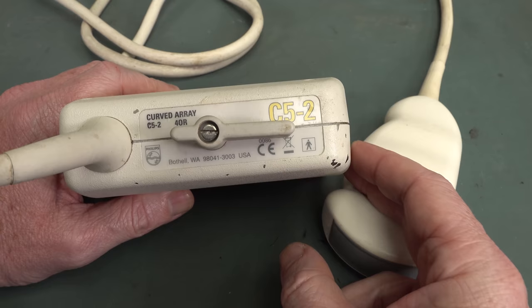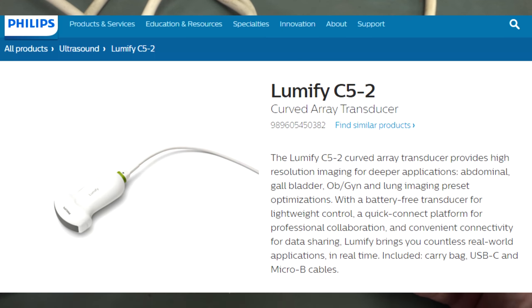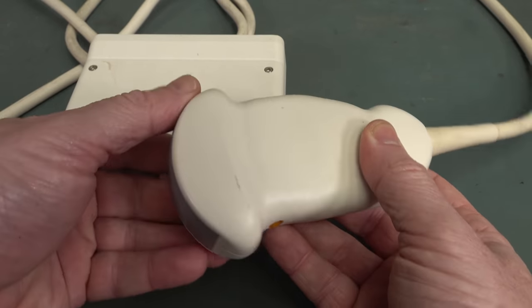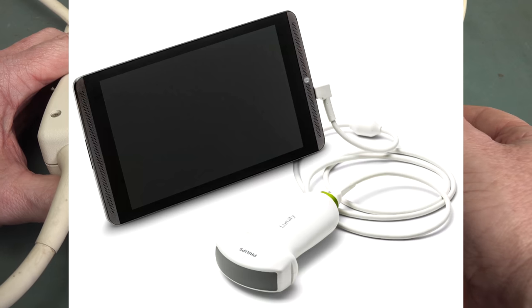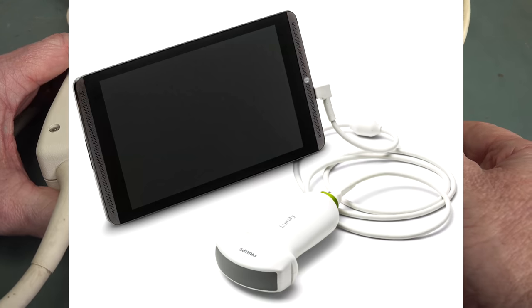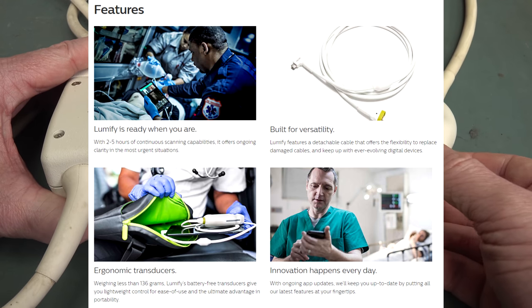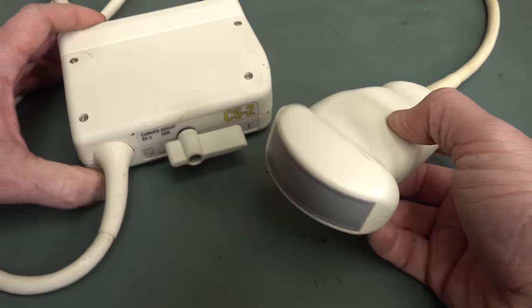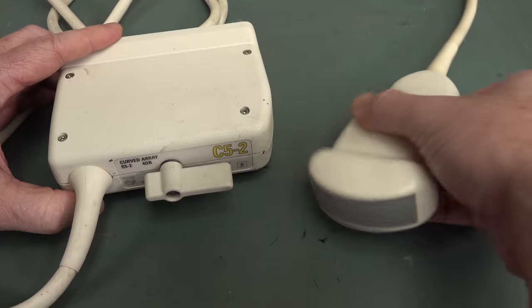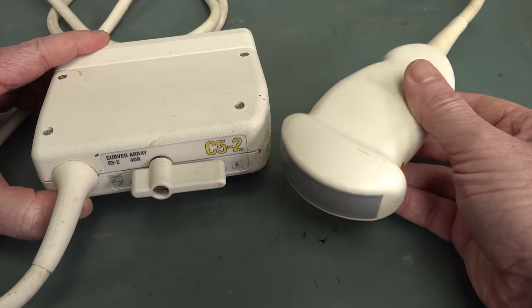This is one of the probes compatible with the HDI 3000 ultrasound, the C5-2 curved array. This is Philips branded because Philips bought out ATL in the mid-90s. This is the C5240R. Philips currently sell a C5-2 ultrasound probe that looks very similar to this. This is actually a curved array - that's why they call it a curved array, because it's actually curved like that. This particular curved array, the C5-2, operates from 2 MHz to 5 MHz range, and it's got a 67-degree field of view.